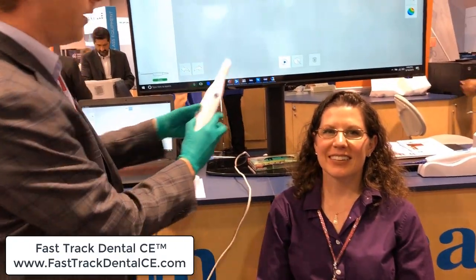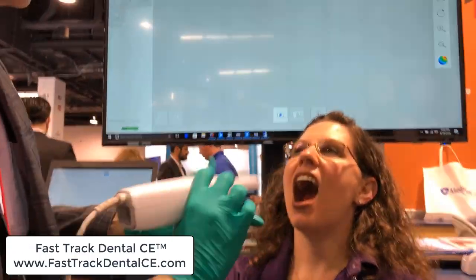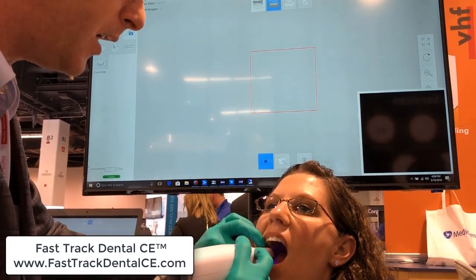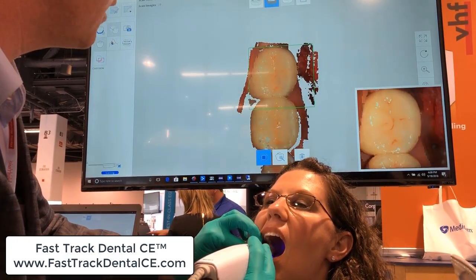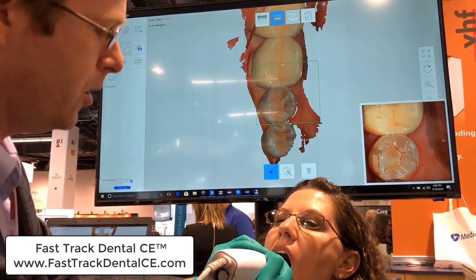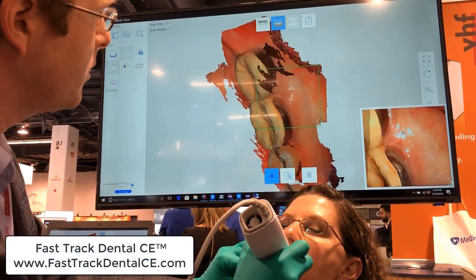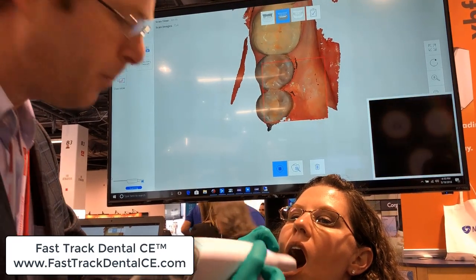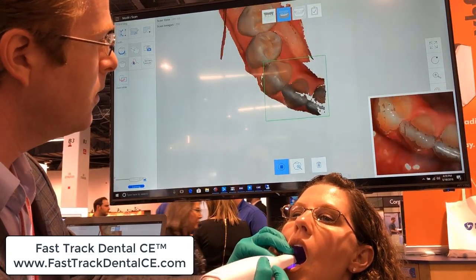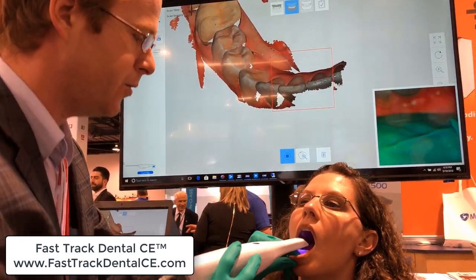Here we go. I'm going to come right here to the mouth. We've got our timer going. I'm going to hold it like a pen grasp — I find that a little bit easier than my Trios as well. Coming here to the occlusal surface, starting the scan on the occlusal. Same scan strategy as I would use for Trios: capture a bit of that occlusal arch, then go to the lingual, capturing all the way around — all those margins, all those edges. Take a little pause, come back to the occlusal, and slide all the way across, capturing buccal-lingual at the same time.